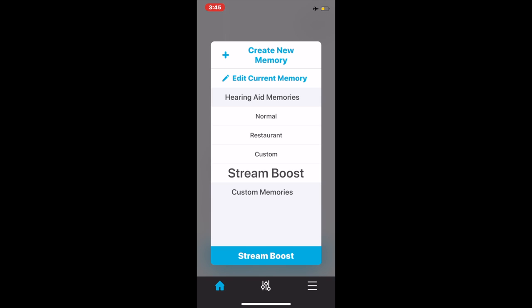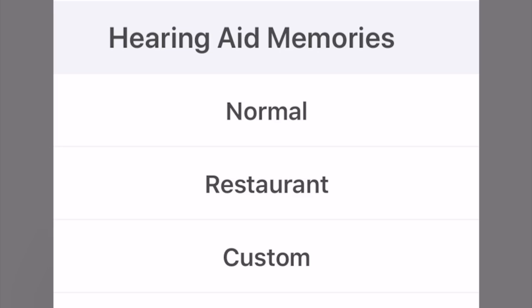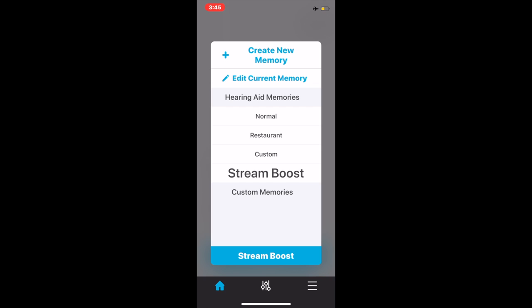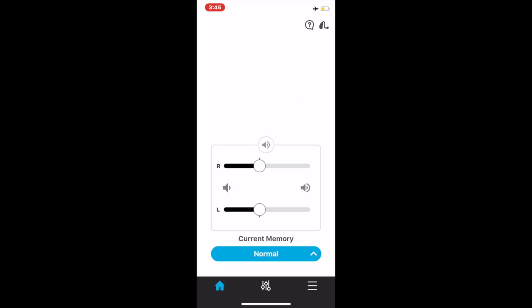The two memories that the hearing aid has programmed inside the hearing aid is normal and restaurant. Then, of course, the stream boost is an automatic memory. It will go to this memory any time you are streaming from your device. So, I am going to go ahead and change it to normal.